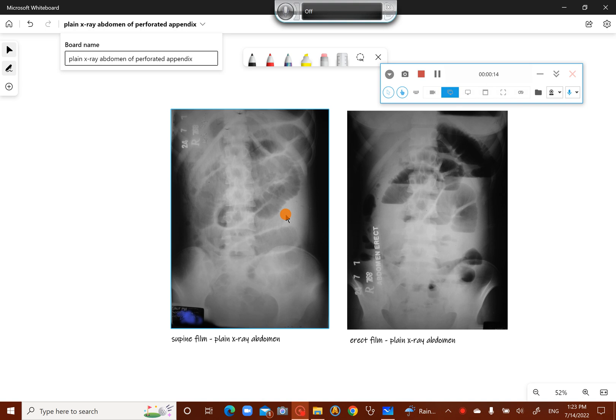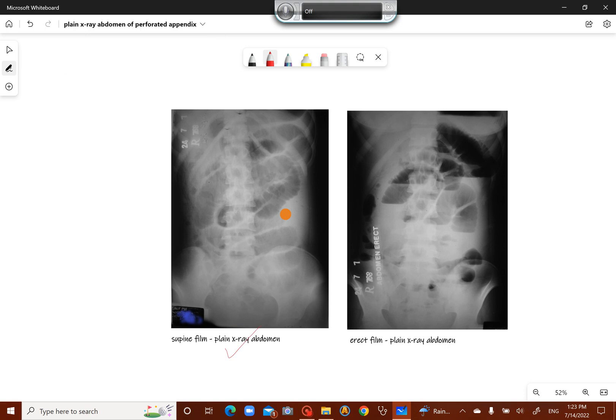Now let us start with the supine film. In the supine film, you can see the center of the abdomen is occupied by dilated gut. These dilated guts are small bowel loops. You can see valvulae conniventes — transverse striations — which are typical of small gut dilatation. So this is the center of the abdomen occupied by the dilated loops of the small gut.